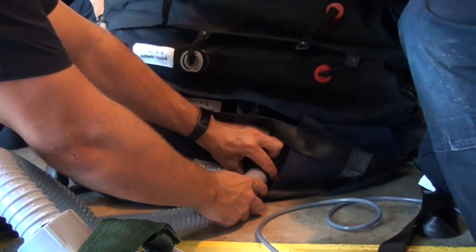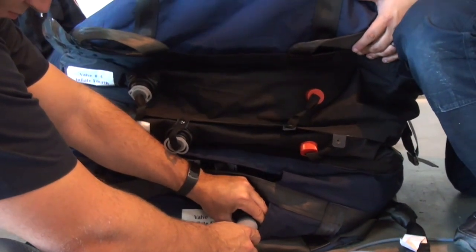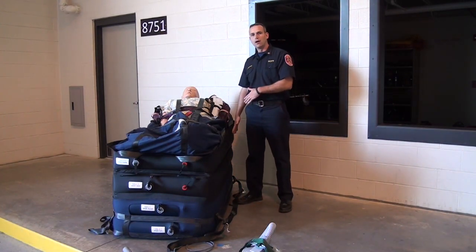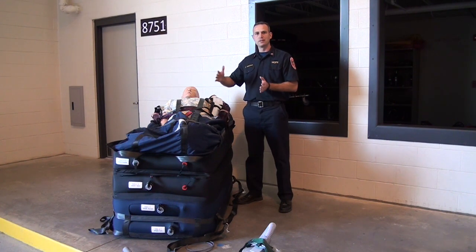As the air chamber fills, it won't fill evenly, so it's important that we have providers on either side of the air jack as the chambers are being filled, so that if the patient begins to roll, we have a provider there to protect them.